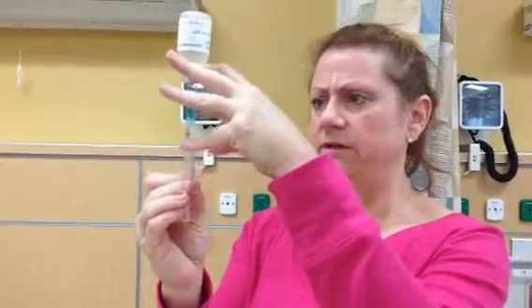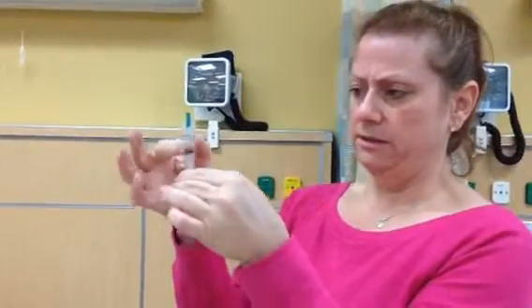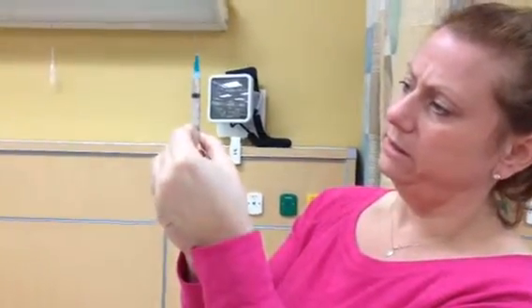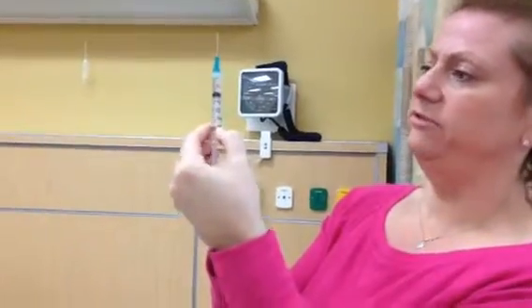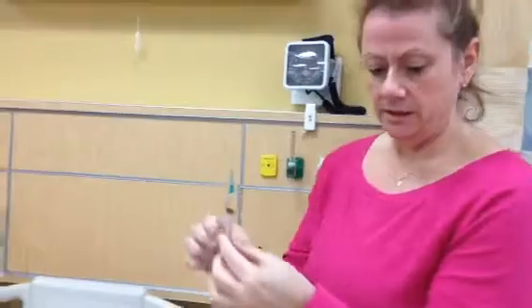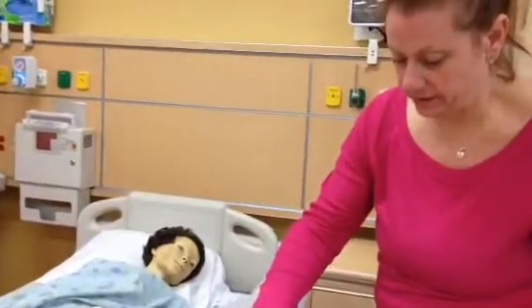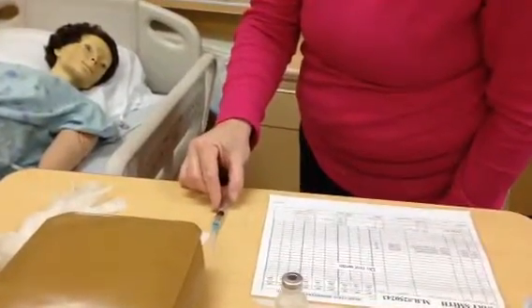Pull this off. Tap it. Get all the air bubbles out. And then I will move this back up by twisting slowly to the 1. This will make sure that all the air is out and that the needle is full of medications. Okay. I will then put the cap back on using the scoop method. Put this down, and I will prepare to take the medications into the patient's room.